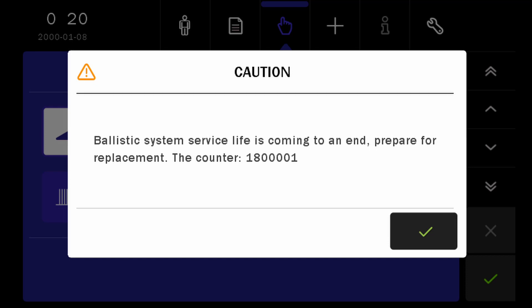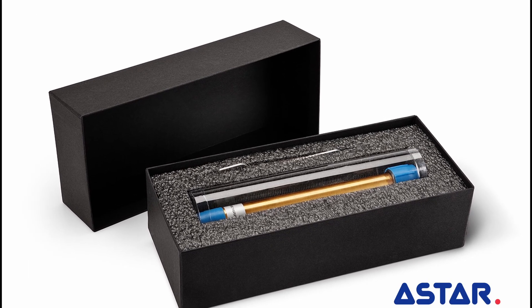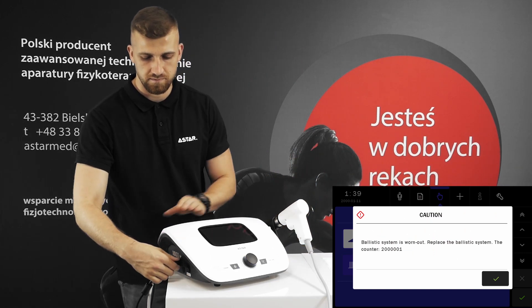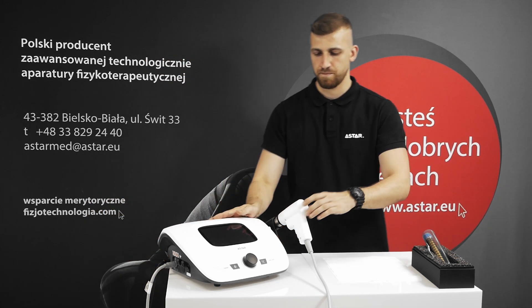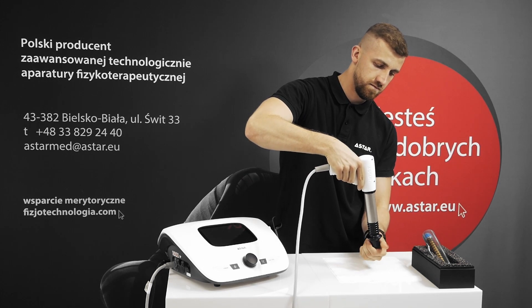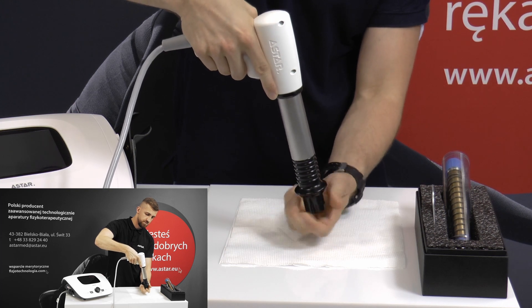When a message about approaching 2 million shocks for the projectile system is displayed on the screen, acquire a new projectile system. After reaching 2 million shocks, disconnect the device from the main supply. During the following steps, try to hold the applicator with the mouth of the ballistic kit pointing towards the floor. In this way you will avoid accidental foreign bodies getting inside the barrel.